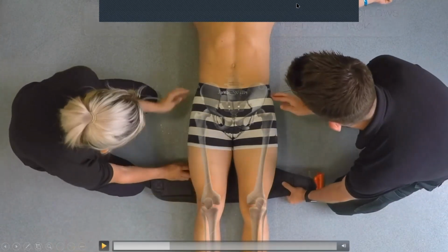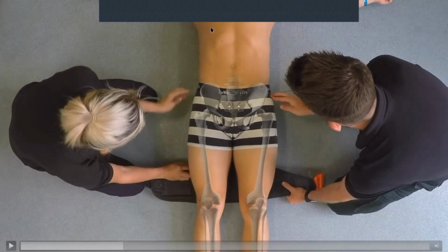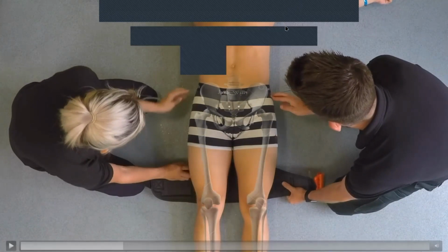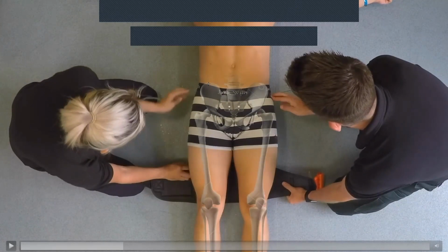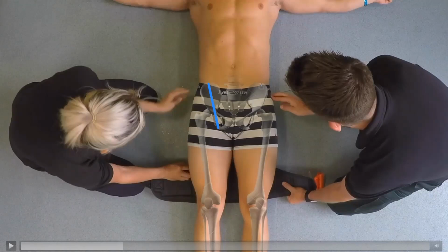So imagine that and let's annotate this a little bit. I just want to draw this out. Let me get a nice color here. All right, so let's look at what our pelvis looks like. That's where our pelvis is, and this is more or less the axis that it's sitting on. Now, I want you to imagine that you insert a pelvic binder across here, which is what I've seen a lot of people do. What do you think is going to happen to that axis?